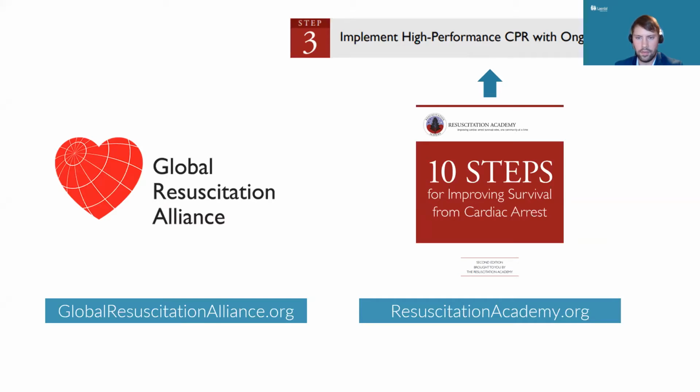So now that we've covered the concept of high performance CPR, I think we're at a good place to hand it over to Mette so she can take over and give you the product showcase and demo of our new and existing solutions. So take it away, Mette.